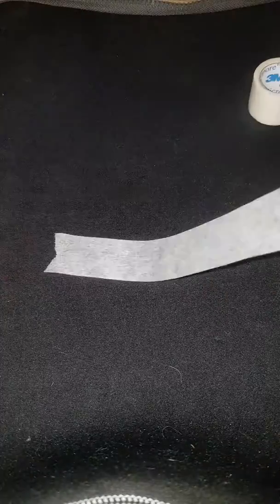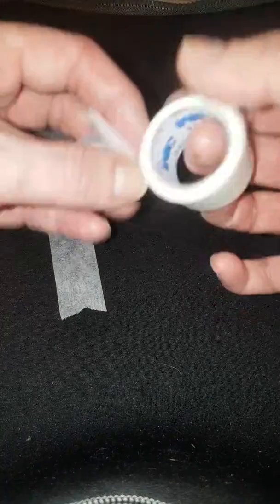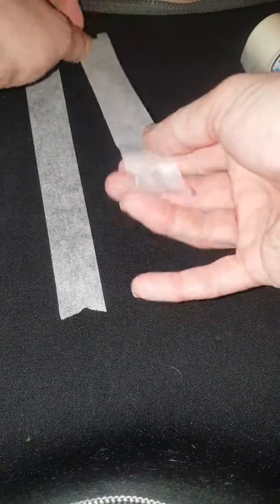So we take one piece of tape, possibly about 10 centimetres in length, pop that one there, and then we take another piece, again about 10 centimetres, and pop it there.